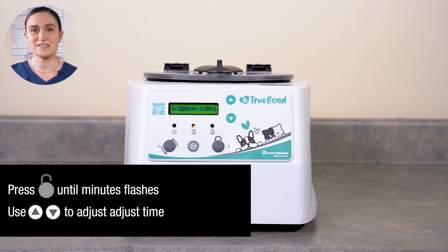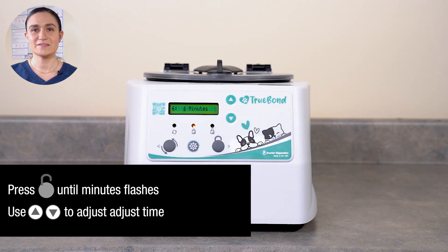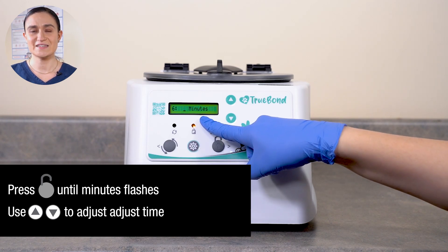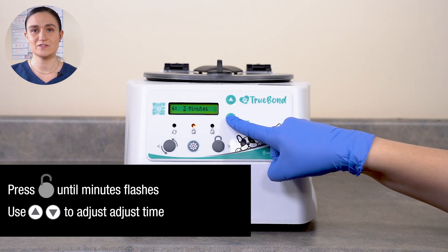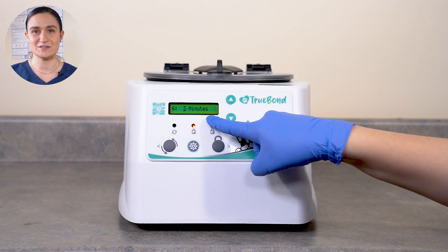Once your desired speed is set, press Stop Unlock again. You'll see a flashing number and the word Minutes. This indicates you are now editing time, which is measured in minutes. Use the up and down arrow buttons next to the screen to adjust the time. The current value on the screen will update as you adjust.